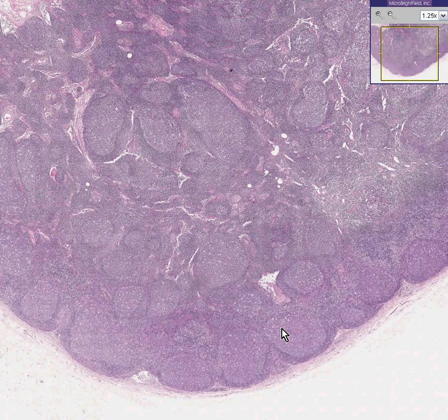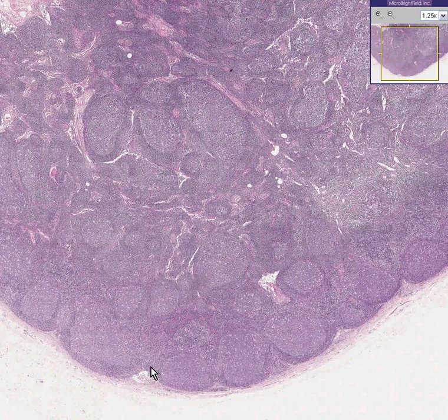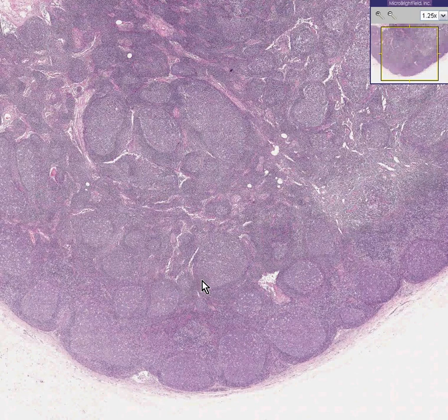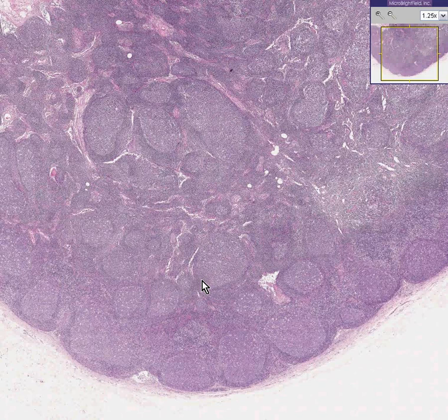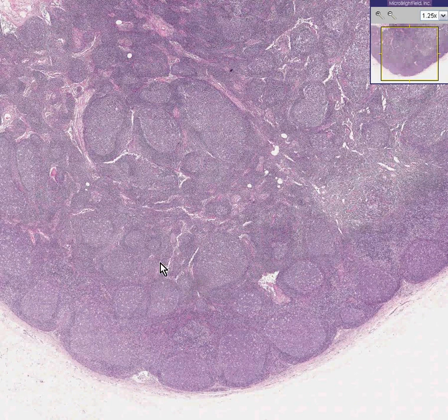This is a benign hyperplasia, or what they call a reactive lymph node, or a hyperplastic lymph node. And because it's chiefly due to follicles, this is follicular hyperplasia of a lymph node. A lymph node generally responds to inflammatory stimuli in two ways, and this is one of them — follicular hyperplasia.